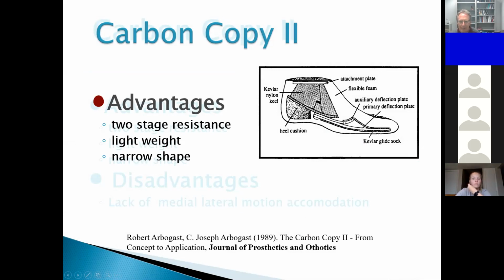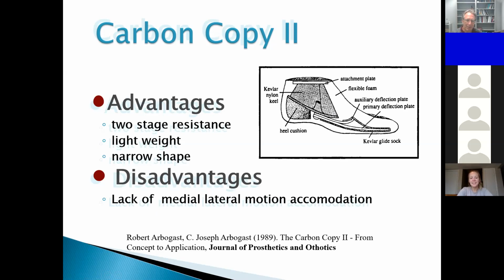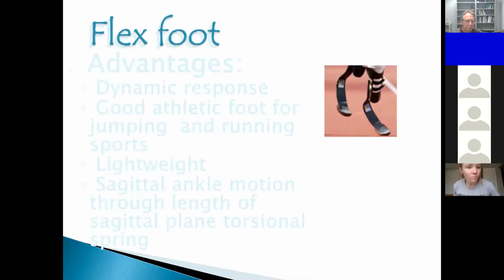And then this superior plate is just doubled up, and so it's stronger, like your actual ankle joint is stronger than your MTPs. And when that doubles up, it also gives some energy return. So it was designed to, in that way at least, during terminal stance, provide a more natural gait. But it's very stiff, so it doesn't allow for medial lateral torque accommodation.